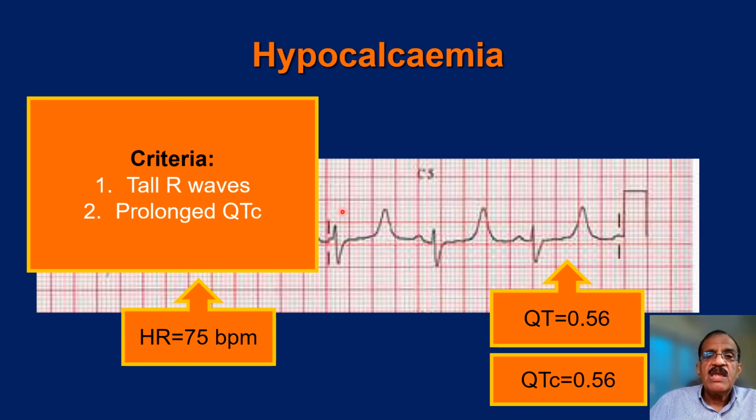I would suppose if there's a patient of hyperkalaemia, I would, on the basis of ECG, make a diagnosis, start treating, and then immediately send the blood also for testing. Calcium is a lifesaver in hyperkalaemia unless it is caused by or associated with digitalis toxicity.